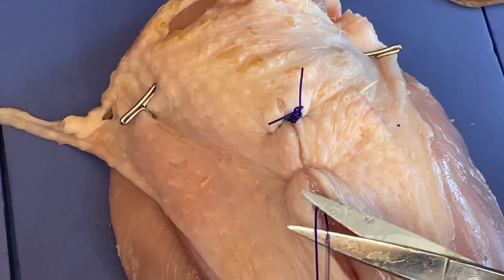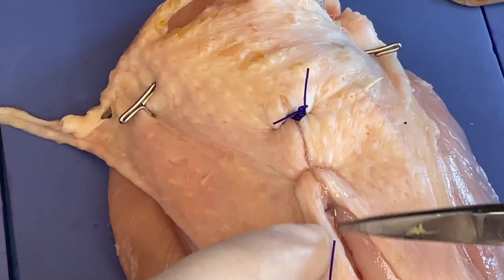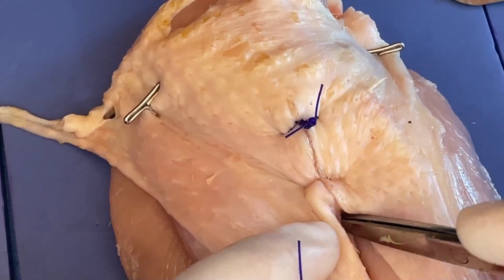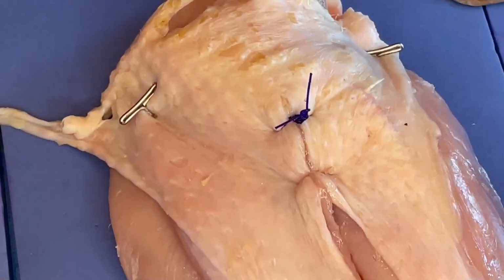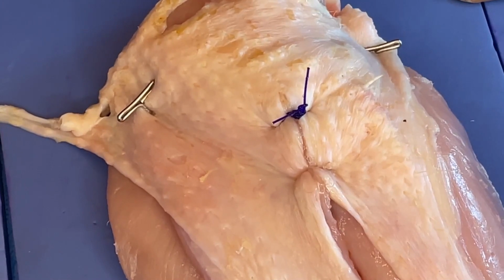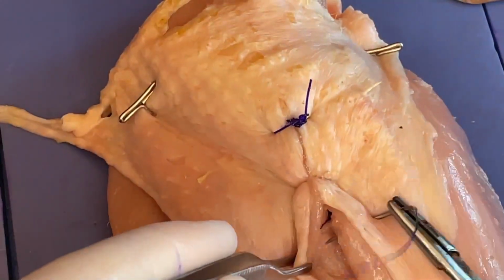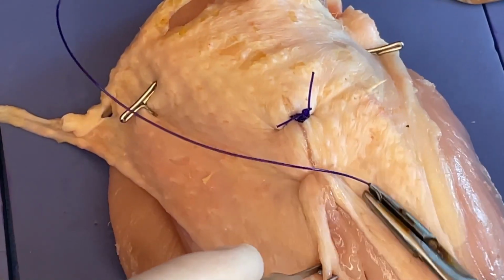But now, instead of having that huge knot sticking above the skin, it is buried down in the tissue. So that's one thing that you can do with PDS, is to bury that knot so that it's not sticking up quite so much. The other thing that you can do, and here we're just going to do kind of our traditional interrupted.